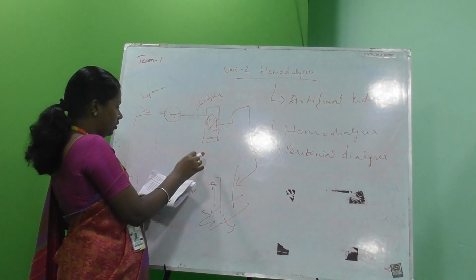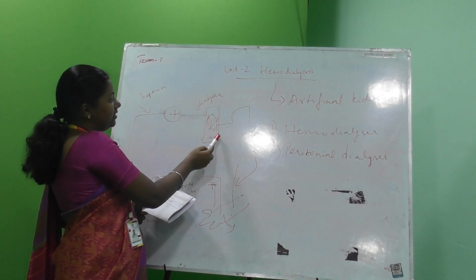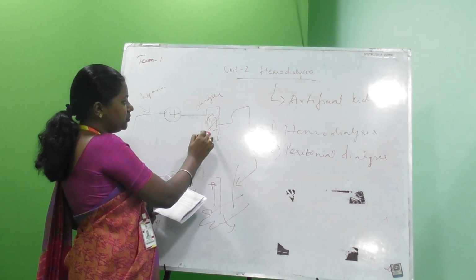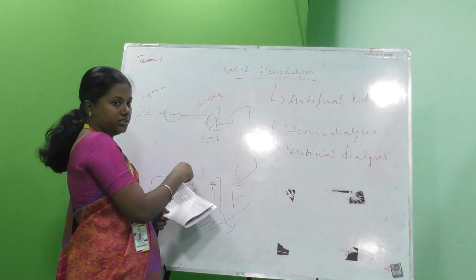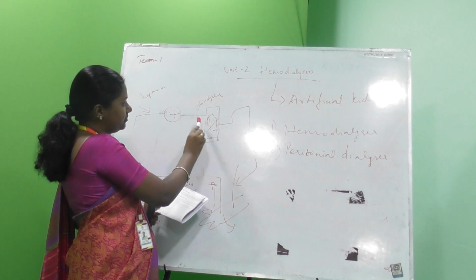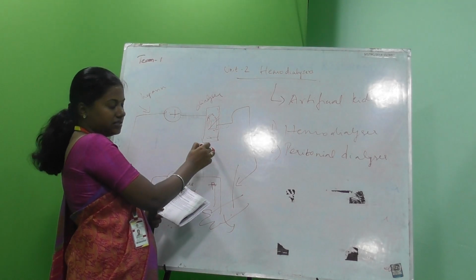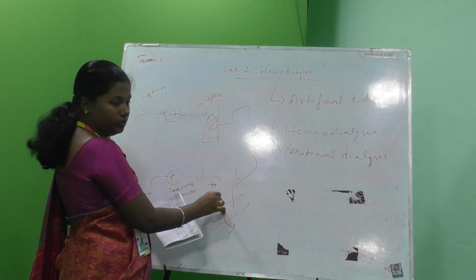It consists of hollow fibers. When the blood comes in one direction, the dialysate solution flows in the opposite direction. Here the osmosis process takes place. Osmosis is nothing but the movement of a substance from higher concentration to lower concentration. Here the unwanted waste products move from the blood and are carried out through this diffusion process. Then the remaining pure blood moves again to the human body.